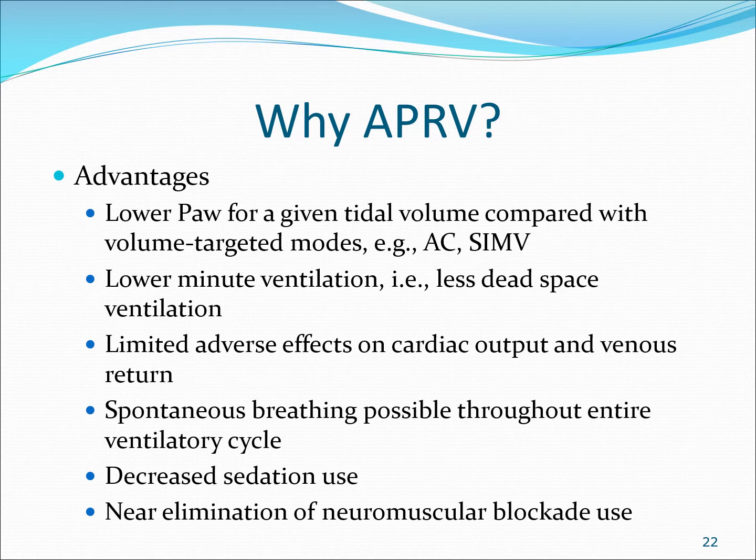Now, here's a very good thing. Numerous studies have shown that if you use APRV, you could decrease sedation use, and you really don't need neuromuscular blockade at all. So you don't need to paralyze patients. These are all really, really important things to make a patient better.